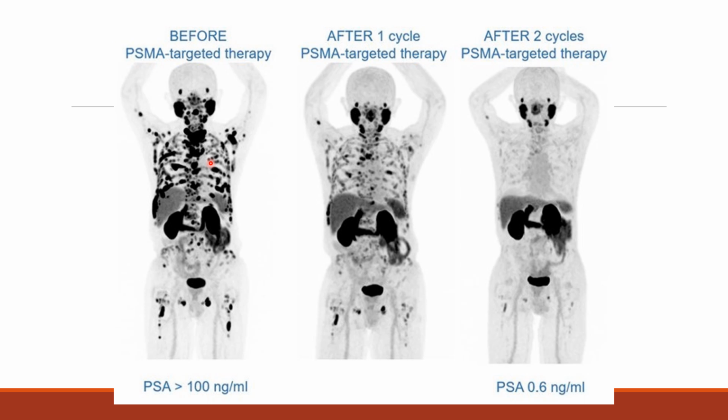It's really bad. But then for the PSMA, they got their Pluvicto. After 1 cycle, it responded pretty well to the Pluvicto. You still see areas that are really avid with PSMA, but for the most part, it knocked them down. After just 2 cycles, that's a ton of improvement. And it's knocked down almost to normal uptake. You still see some little areas. You see the areas that were really hot, like in the arm and their neck and their chest and their leg, are still taking up a little bit of PSMA, but if you look at the SUV values of that, it's a lot different.